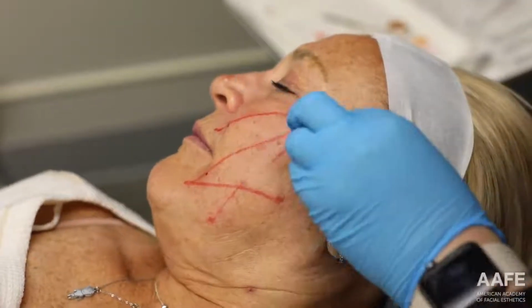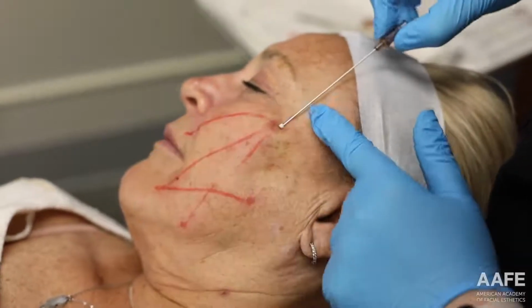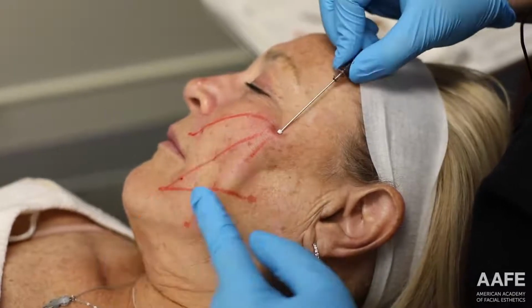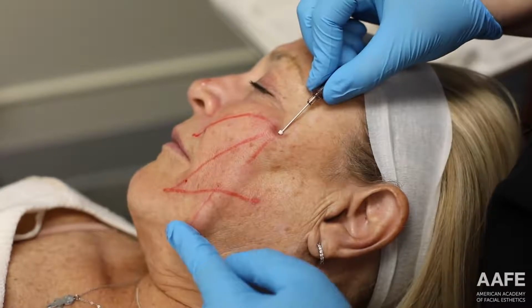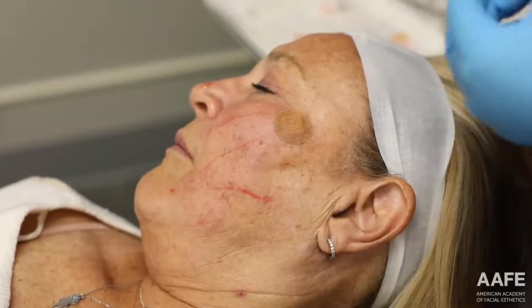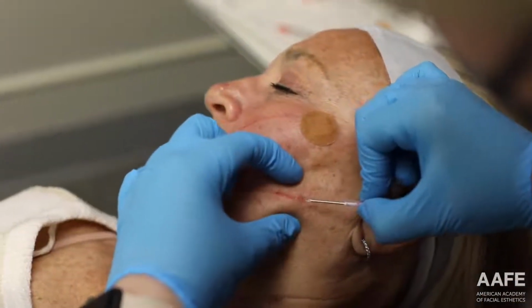So we're using the same threads over here. You can see that I'm kind of diving a little deeper to get in, and then once I'm in there, I kind of level off because I know that I'm in the correct plane. Always checking my tip, making sure it feels good. Perfect. Okay, so just her jawline. So I already numbed down here a little bit. So a little pressure.